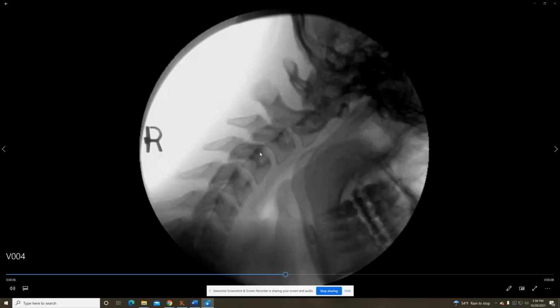So what's happening is that we've got some ligament instability back here. As this person is moving, the muscles that attach back in here try to guard and protect this area. They're trying to pull this back because in here is where your spinal cord is, and back in here is where all the nerves exit. So they want to have as little pressure on that as possible. Your body does. It would rather have these held in place than potentially moving and having a vertebra move into the spinal canal.